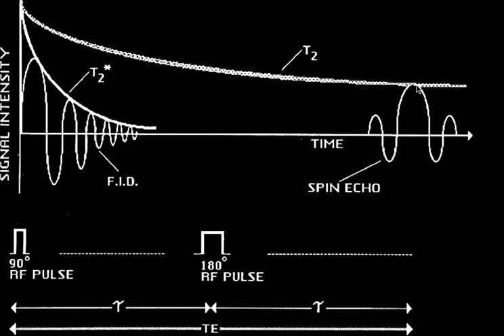And the peak of this signal will only go as high as the T2 curve. It cannot go above that. Okay? Okay, Yuri, well, why can the signal get no higher than the T2 curve? Why can't it go back up to the baseline signal that was way up here?